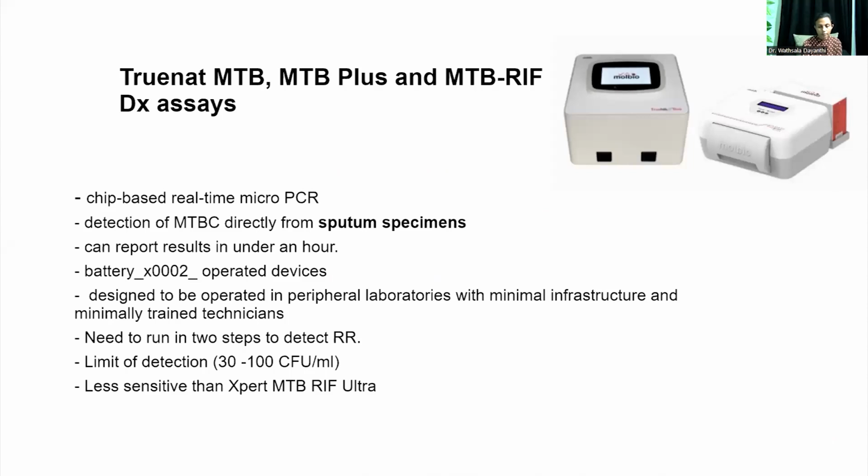So, some words about TrueNat machines. This has not been implemented in Sri Lanka yet, but we have 17 TrueNat machines, which the Health Ministry has got as donations for COVID testing. So the TB program is trying to relocate these machines and take them for TB testing.